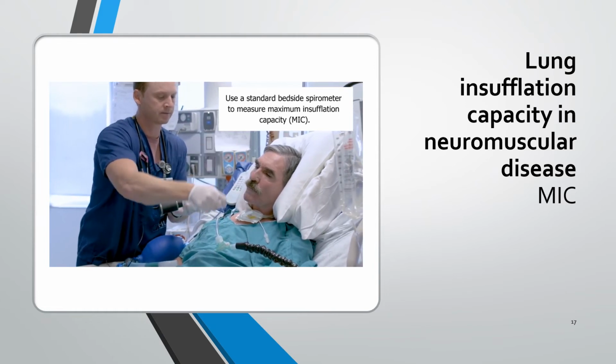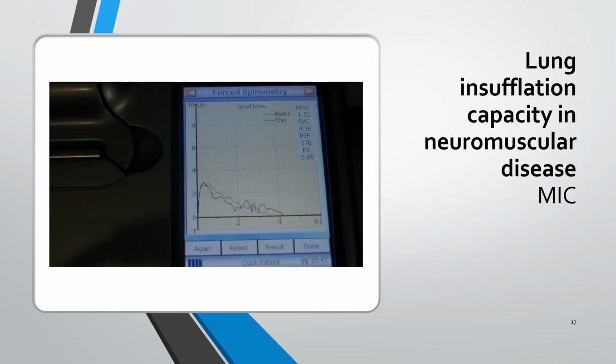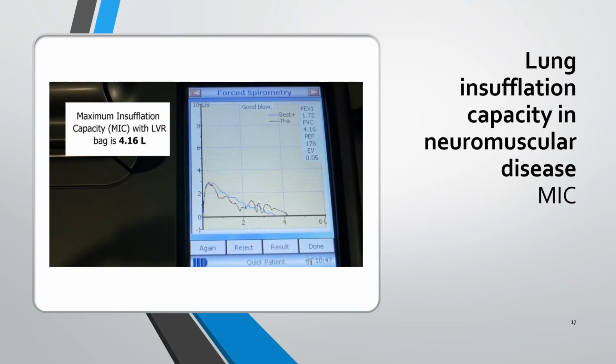Okay. Back up. Okay. And Greg, your volumes with the manual bag are 4.16 liters.